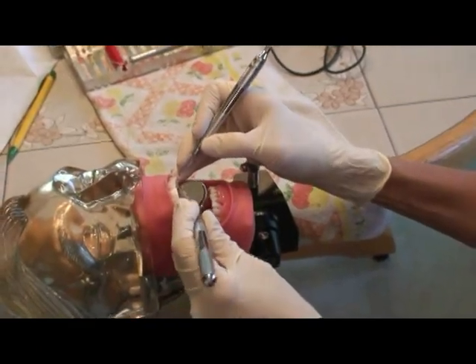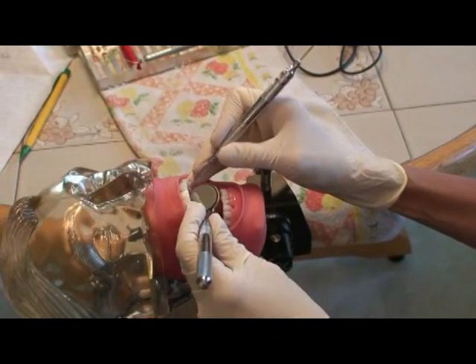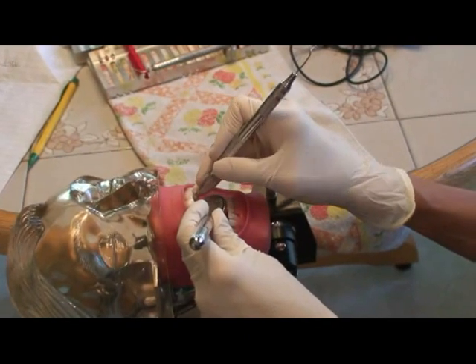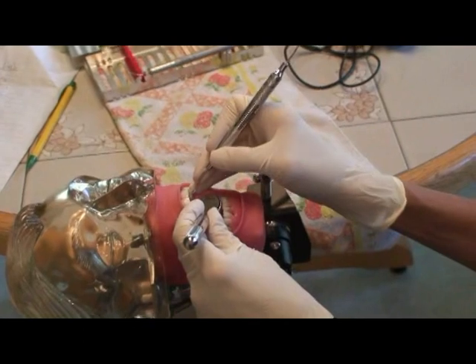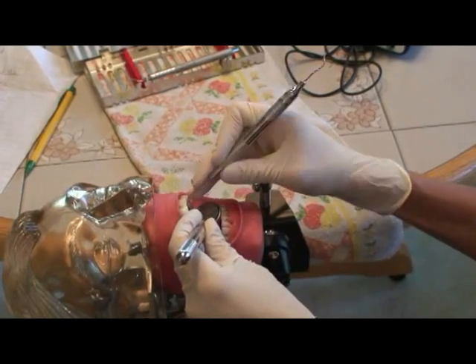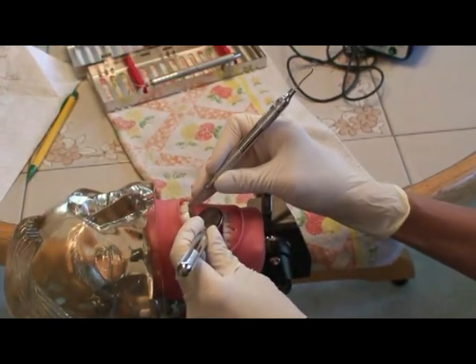Upper anterior lingual surfaces towards you. Back up the fulcrum to the bicuspid. Use indirect vision. Start at the middle of the tooth and rock. Rock and roll. Roll interproximally. The fulcrum moves along almost with every tooth.